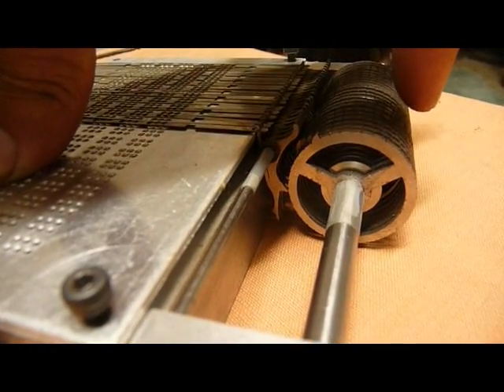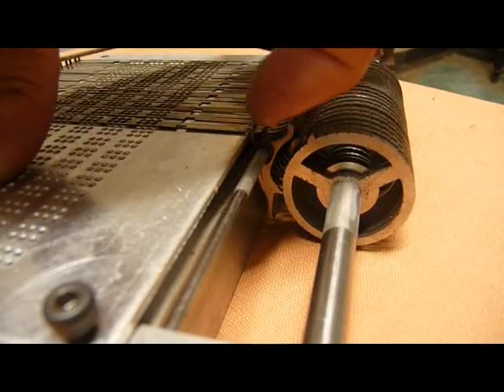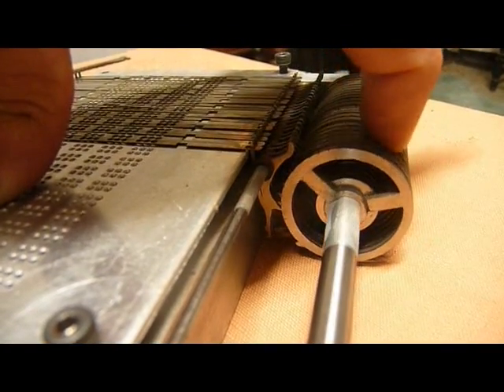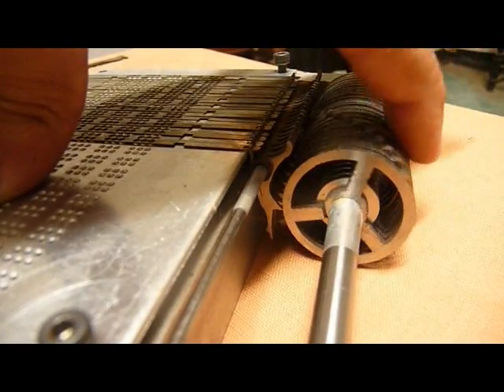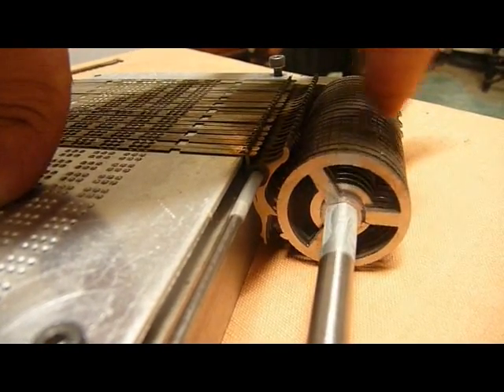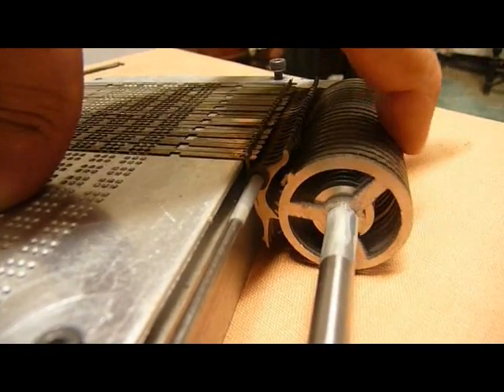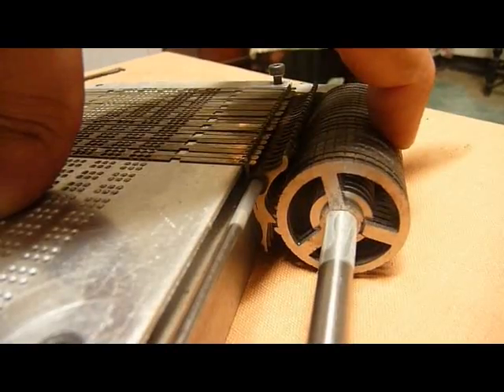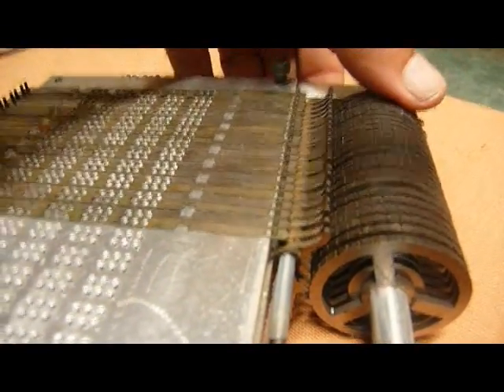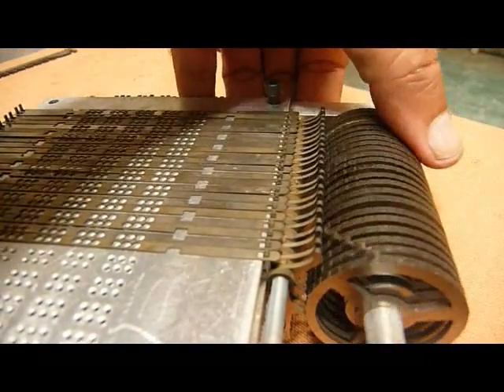In this picture, I've left the bank of cams open so that you can see the pawl over here, how they pull. As the cam turns, you just watch how it triggers. So just every revolution, only one lightly toggles the unlocking slide, so it unlocks and locks immediately. So that way the whole bank, watch like a ripple that just passes along.